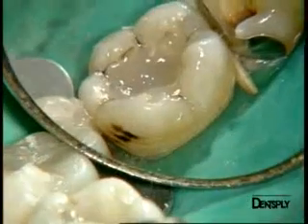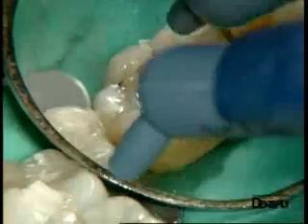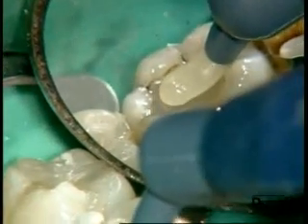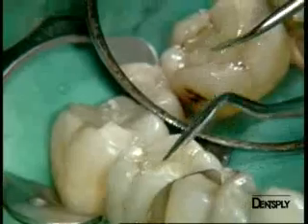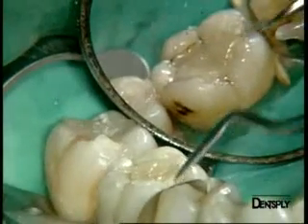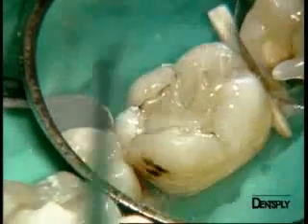We cure and, with the same procedure as before, we add several small increments to reproduce the details of the various anatomical structures. A slightly more pointed instrument makes it easier to reproduce the thin details of the tooth. As our patient is young, all features are therefore deep and clearly marked.